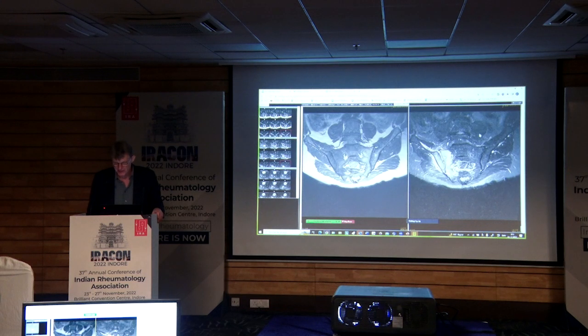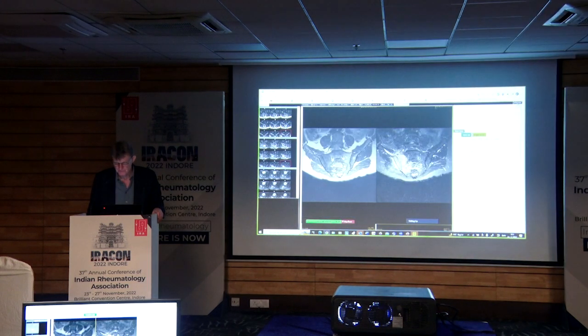Right, so please put in your votes. So I guess you have done that now. There are 33, okay, that's quite impressive actually. 33 cases here, and everybody says that there's bone marrow edema. Quite a lot says erosion, a few sclerosis, and a few fat infiltration.